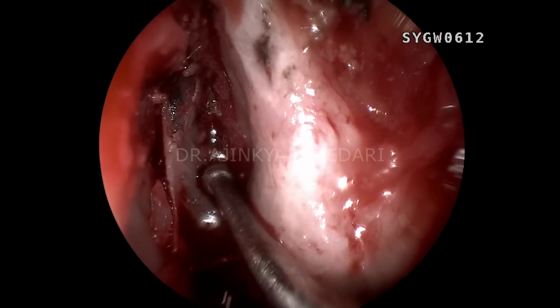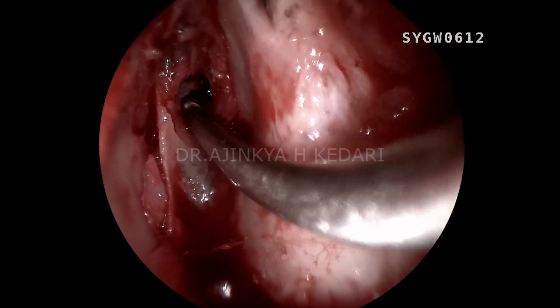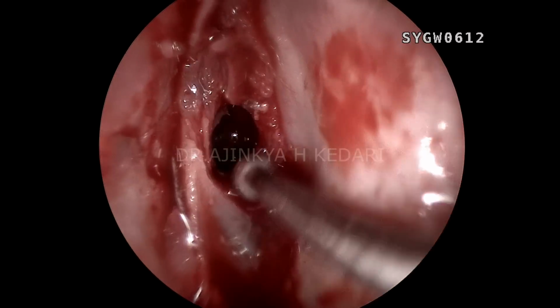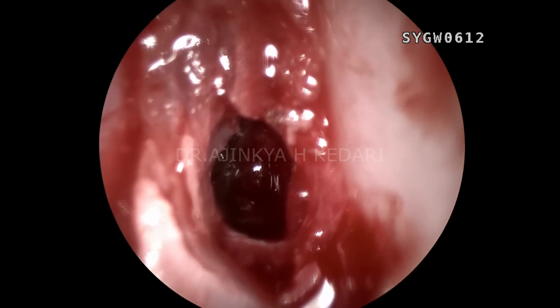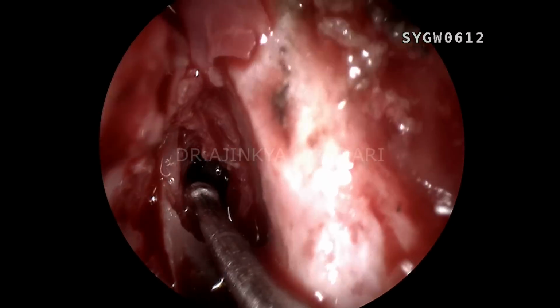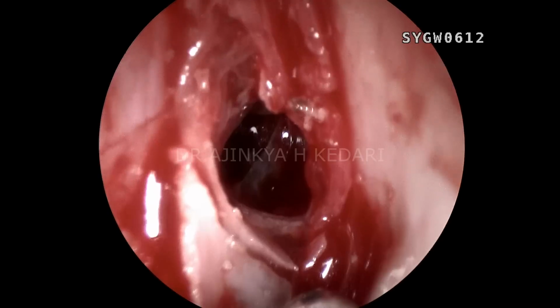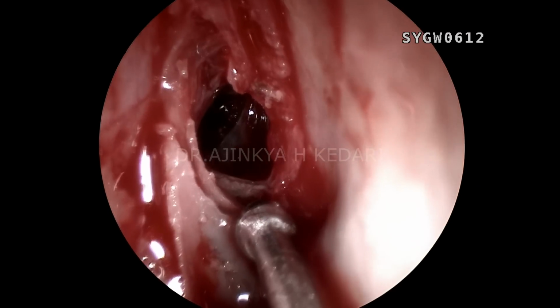And coming behind, you can see I'm going to pass the ball probe through and through. That's the skull base defect right there. That's a huge defect, and there were a lot of bony fragments. So following the road traffic accident, this patient also had a secondary site of a CSF leak. You can see the pulsations down there, up there, and you can see the multiple bony fragments through the skull base defect. Make sure you remove all these fragments. That's the arachnoid layer you can see inside with pulsations happening.